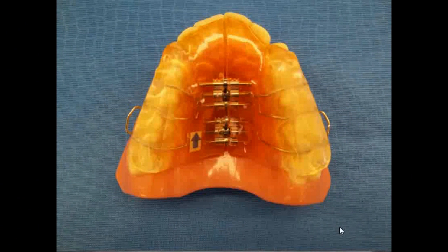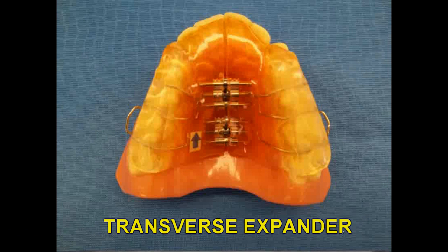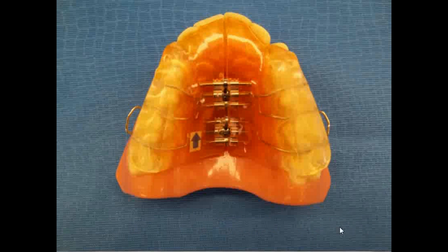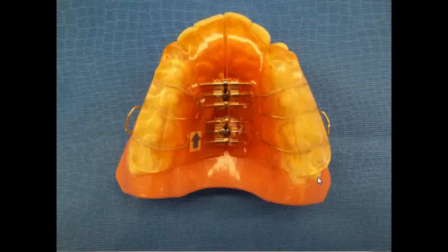A modification to the Schwartz expander is this transverse expander. This appliance was made popular by Dr. John Witzig. It is used in the permanent dentition for teenagers or adults. There are a couple of modifications. First, there's no labial bow for cosmetic reasons only, but it could be added if you needed it. It has occlusal coverage to prevent the teeth from tipping as the arch is expanded and help with retention.